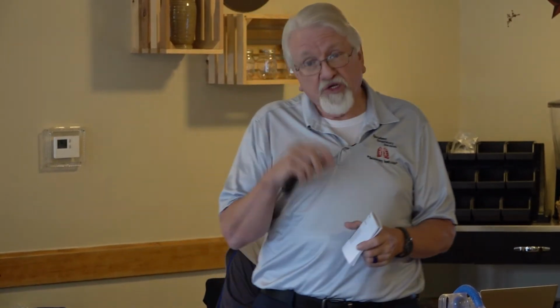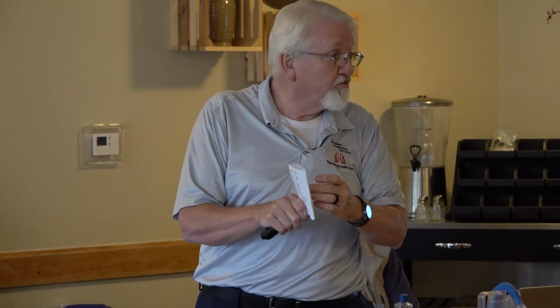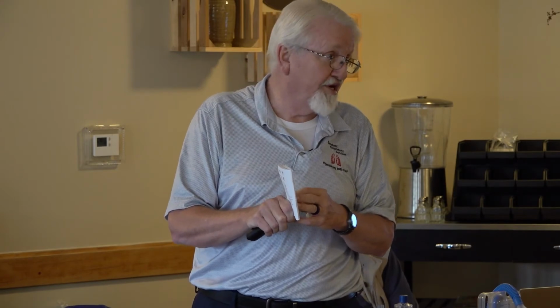So if you have a doctor that writes an order for 3 months, you diplomatically point this out to him. It's 29 days. If he says, I don't care, whatever, that's fine. He's the doctor. You just document, physician was shown the manufacturer's recommendation of 29 days.